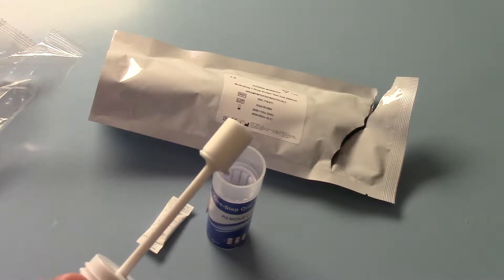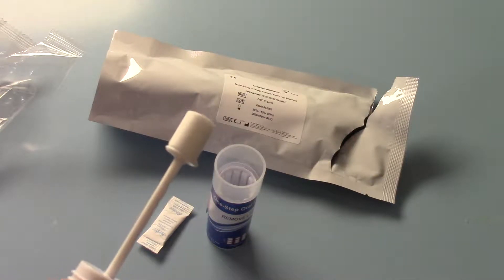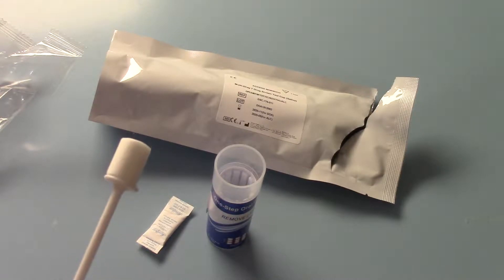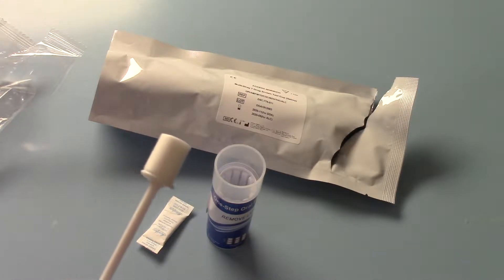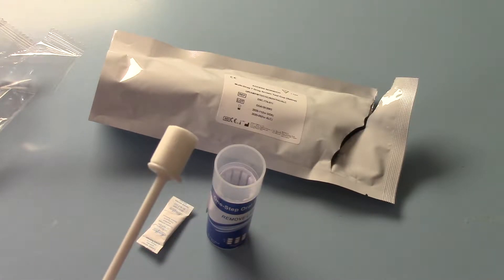This is the swab that has to be put into the mouth. You need initially, before you start saturating it in saliva, to ask the donor giving you the sample to work this around the front of the gums, top of the teeth, bottom of the teeth on one side. Repeat that exercise on the other side. Then inside the mouth, behind the teeth, under the tongue, around the cheeks and on the top of the tongue.